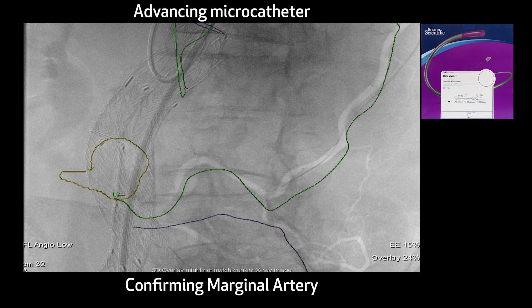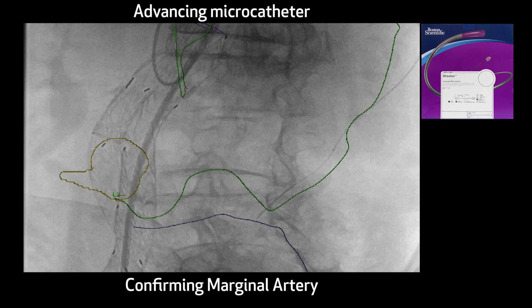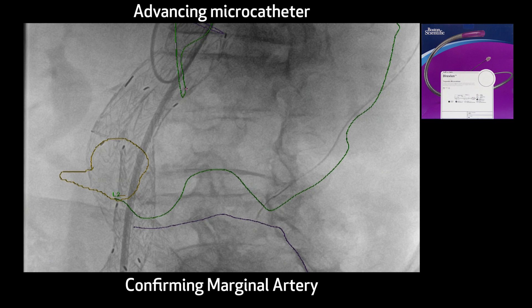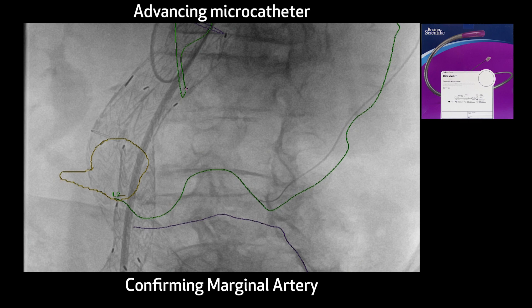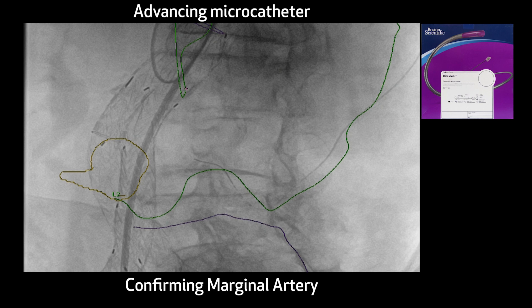Ideally, you want to get all the way inside the aneurysm, and then the plan is to fill that with ONIX, then back out and embolize the IMA, probably with coils. We've confirmed we're in the marginal artery. Now you can see the wire in the microcatheter being advanced. It looks like it's going down a side branch here — just pull back. We usually put about a 45-degree angle onto that guidewire and then redirect towards the marginal artery. You can see we're actually back following that track.